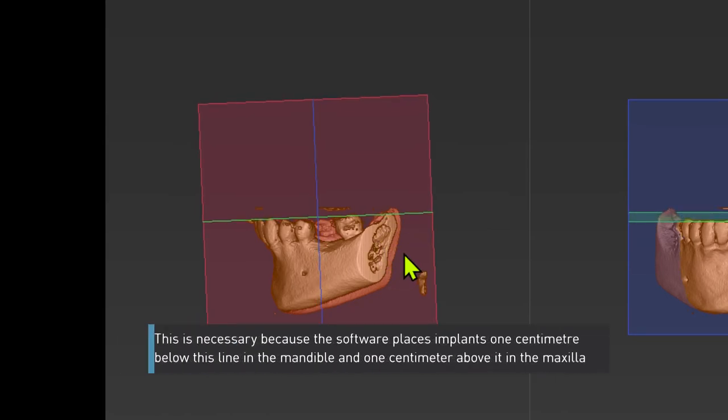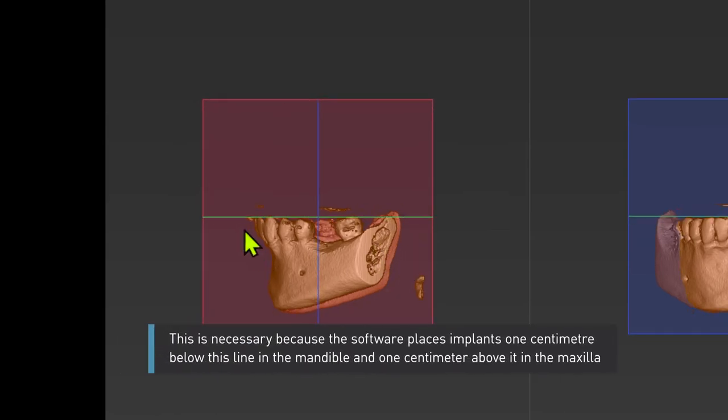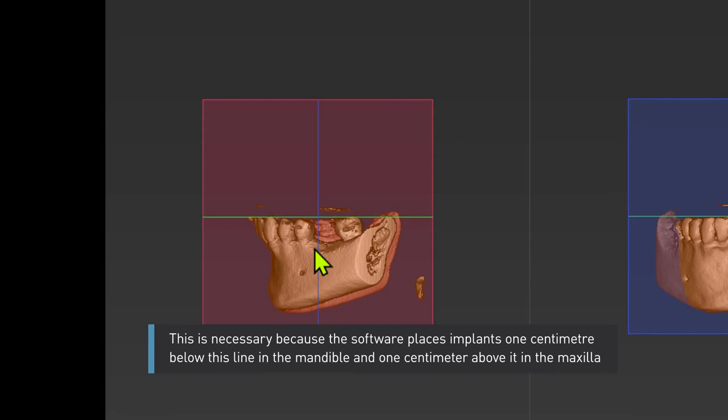This is necessary because the software places implants one centimeter below this line in the mandible and one centimeter above it in the maxilla.